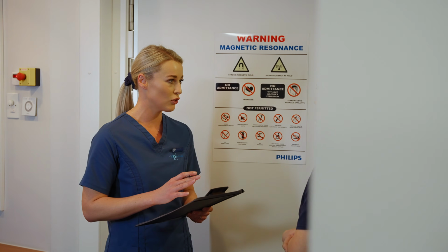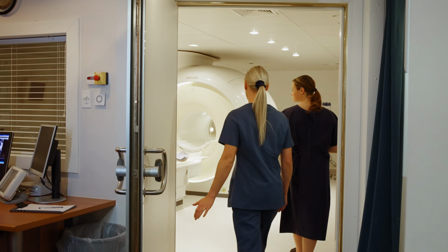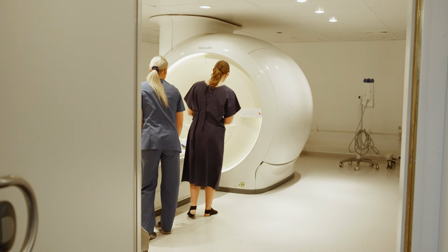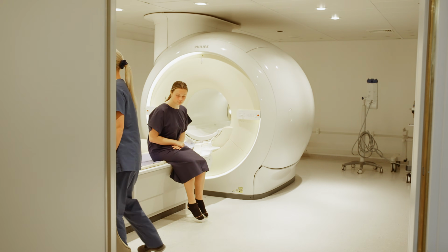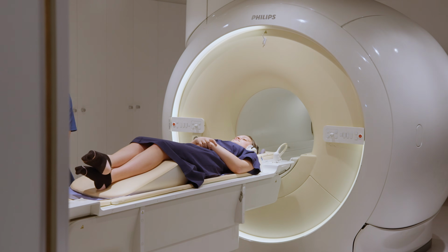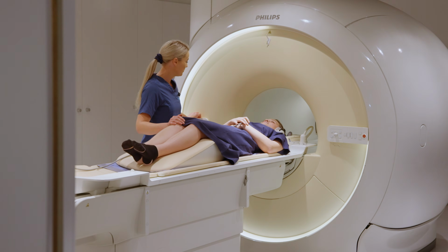Depending on the type of scan you have, we will position and immobilize you as needed. Because of the loud noises of the MRI scan, we will make sure that you are fitted with earplugs as well as earphones to ensure that the noise of the machine doesn't injure your ears. We will also give you a panic button, which you can press at any time to let us know if there is anything that is bothering you.